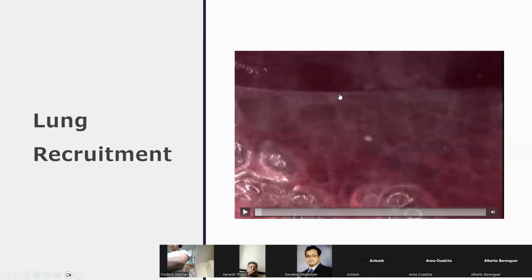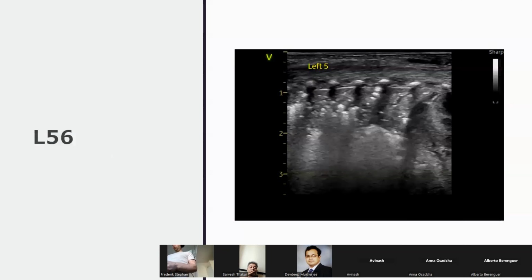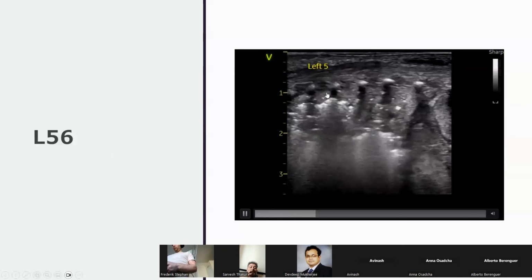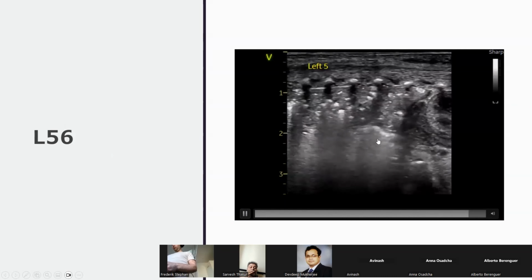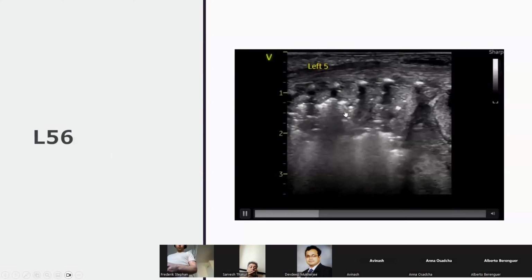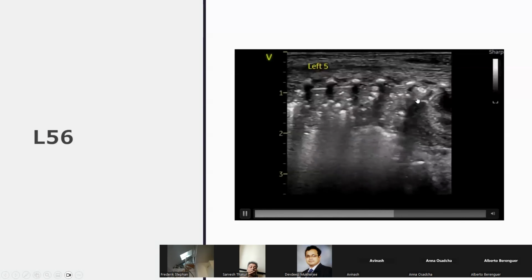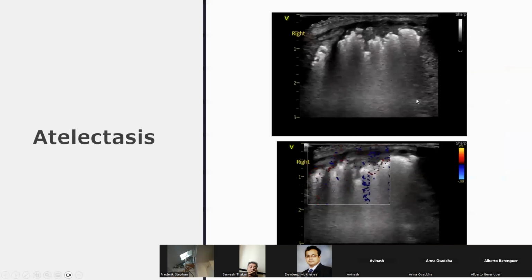At this stage, when you do your lung ultrasound, alveoli completely collapsed, so you will get no pleural line. There's no pleura established because you have no aerated alveoli. And that's why I'm showing you this video. So when you look at those images that I've just shown you of alveolar atelectasis, really the problem is that you've got no pleura. This is all atelectatic lung. And there are certain patterns that give us information that this is atelectatic lung as opposed to just pure consolidation and pneumonia, which is why we're going to try a recruitment maneuver in this baby.